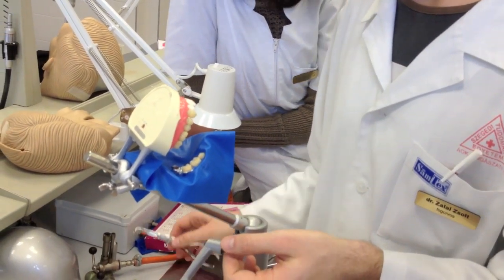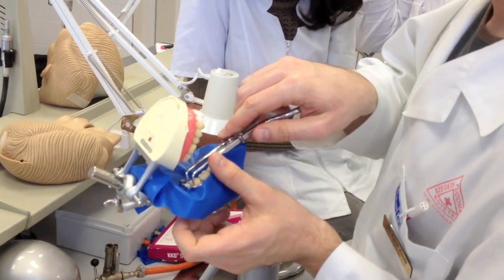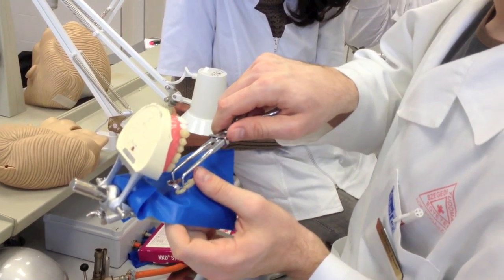Then place it on the other teeth and we're done. These are the four main types of how to apply the rubber dam with a clamp.